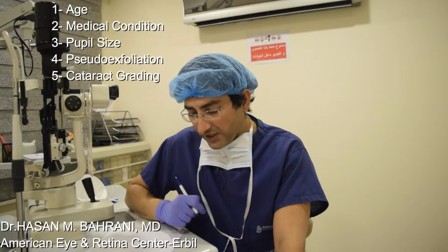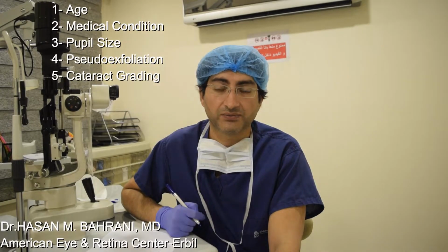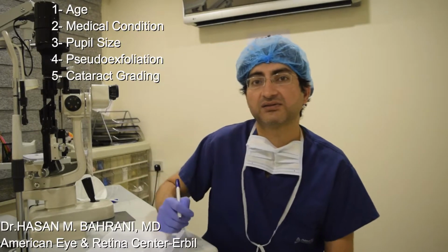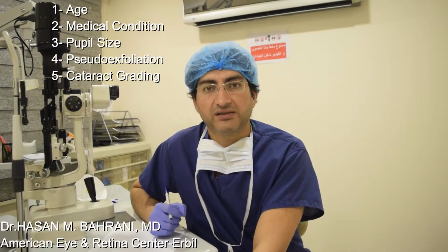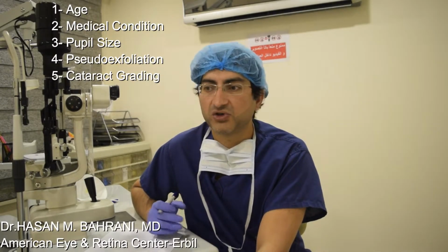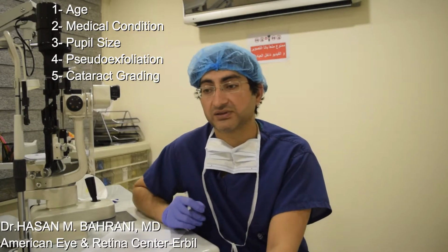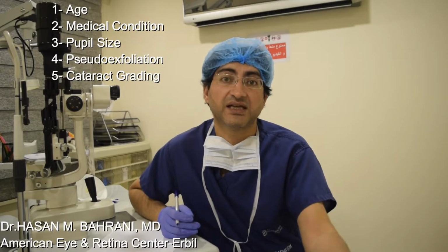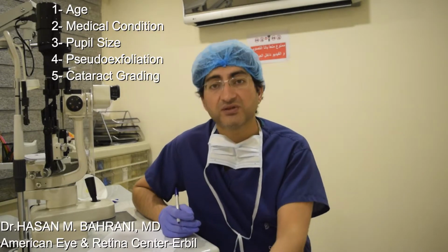So, talking about pseudoexfoliation, the grading is extremely important. I find a lot of residents do not grade cataract accurately. It's really important that you grade the cataract correctly, and you have to grade all of the cataract. Most people say 2 plus nuclear sclerosis, 3 plus nuclear sclerosis. Well, you have to put 3 plus nuclear sclerosis with a 2 plus anterior cortical cataract, 2 plus posterior subcapsular cataract, presence or absence of posterior polar cataract.